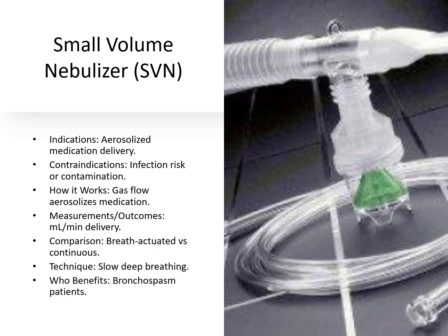Comparisons include continuous nebulizers versus breath-actuated types. Technique is slow, deep breathing. Patients with bronchospasm benefit from this therapy.